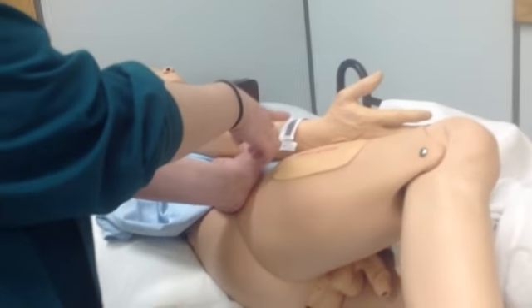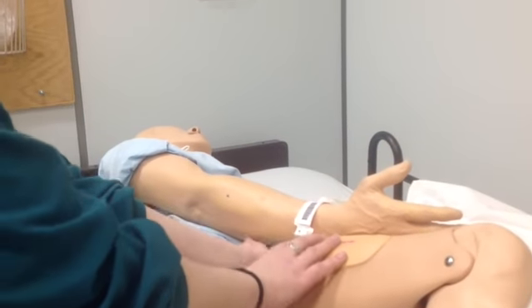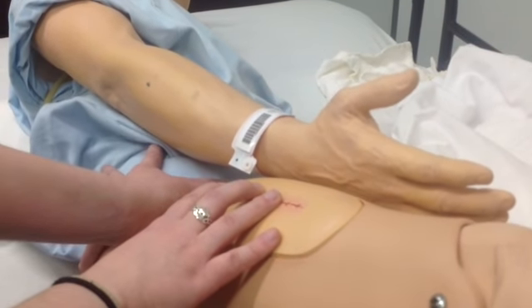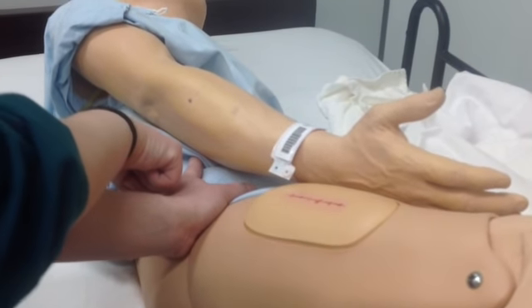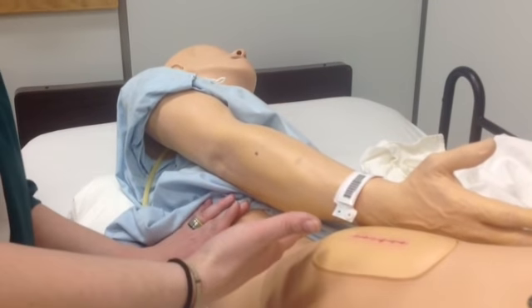The greater trochanter. You're going to put your palm on the greater trochanter. Now, his abdomen and pelvis is this way. So I want my thumb facing in that direction, the interior of the body, the front of the body. So I would find the greater trochanter, and I put the palm there. What I'm going to do with these fingers up here is feel for the iliac crest, and I want to find the anterior and posterior sections, which are right about here. So my thumb will be there, and when I find where those ridges are, I'm just going to spread it out, and my shot's going to go right about here. So I mapped it out. What I'm going to do is roll this back, and I'll perform it again, but I just wanted to go through it first.